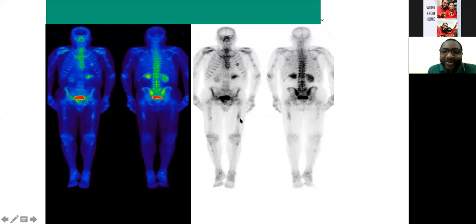One of the important things is that when you are putting together your report, please always raise a flag. Always emphasize that this lesion is in a weight-bearing area, so there's a potential for a pathological fracture. You will get additional marks by doing that.